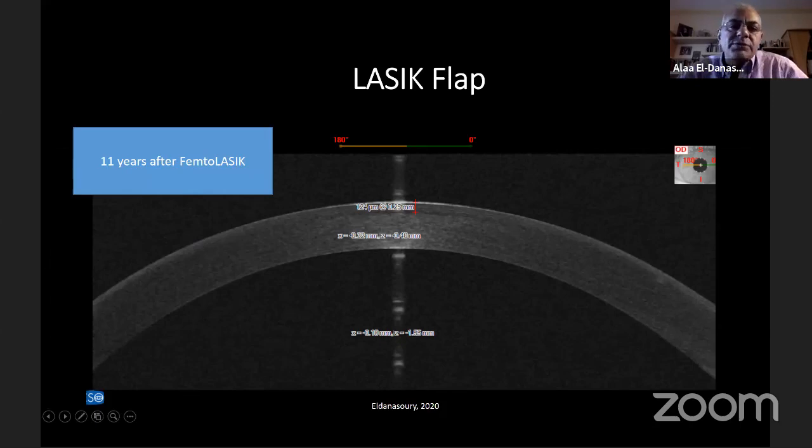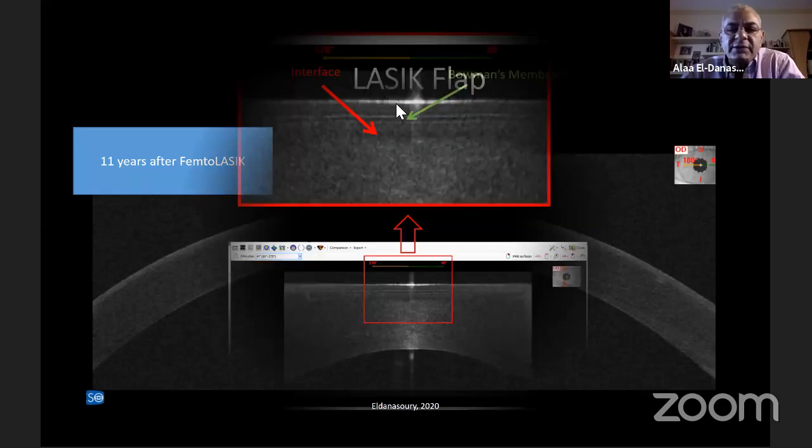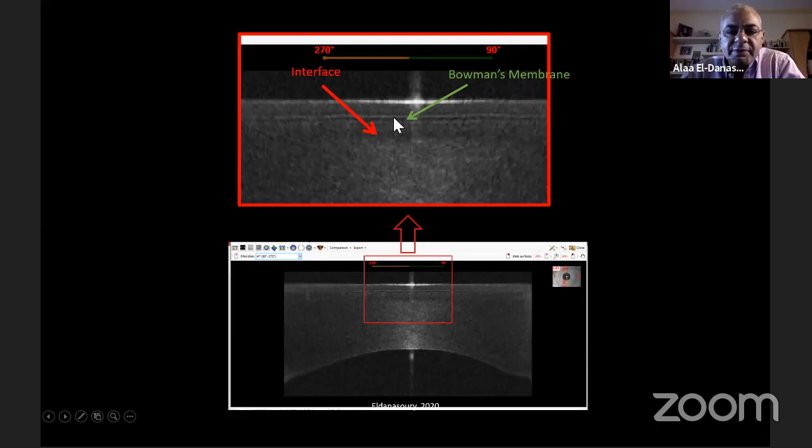Now, moving to post-operative assessment of the refractive surgery patient, if you're doing laser vision correction, then you have this patient who had LASIK like 10, 15 years ago, especially if it's not done in your place, you don't know the thickness of the flap, you definitely need to know the thickness of the flap. With the MS39, you can get accurate measurements of the flap thickness, even up to 15, 20 years. I've seen patients 20 and 25 years after LASIK, and we could very clearly measure the thickness of their flap with the MS39. Here you can see very clearly the epithelium, Bowman's layer, and the interface, and you can measure the residual stromal bed and decide whether you want to do enhancement or not.